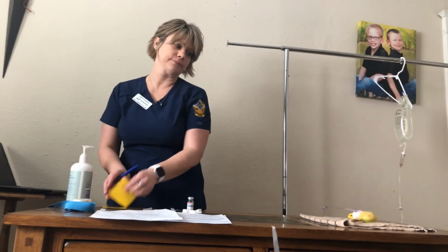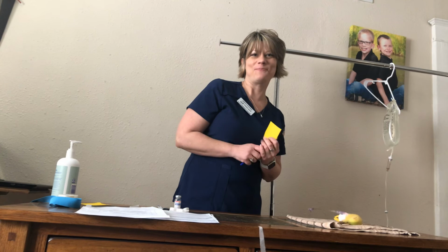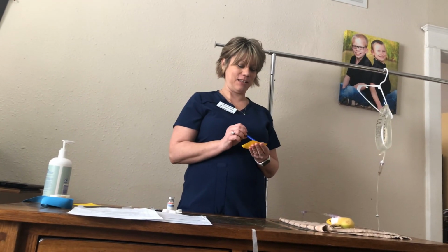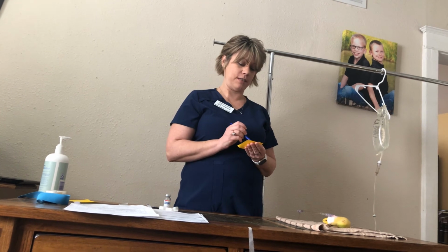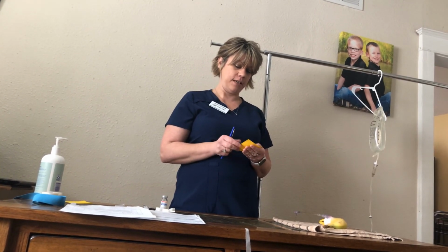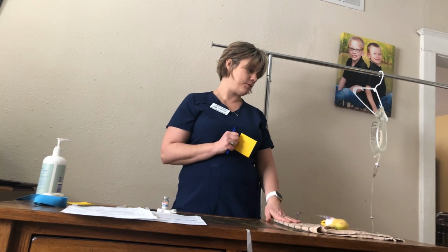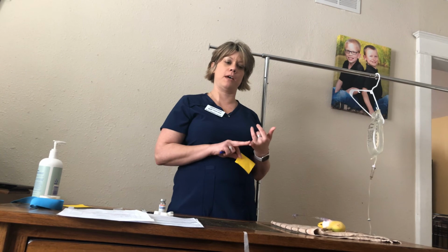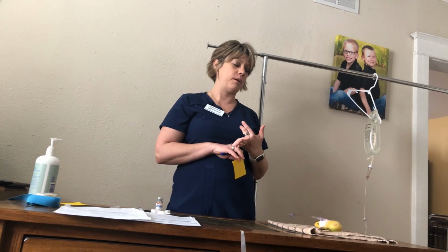I also had labeled my antibiotic med with the med, the base solution, the time added by me, the nurse, the flow rate, and again my initials. That would have been on the bag of antibiotics so that myself and other nurses could double check and verify if there was any question.